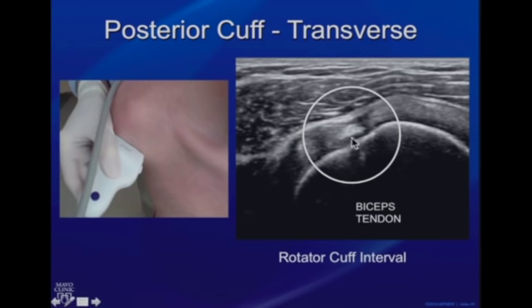Many times in this position, the biceps tendon might seem to be surrounded by a little bit of fluid, but this is okay and normal because there might be a physiological fluid within the sheath at this point, and this is not a tear immediately near the biceps tendon.